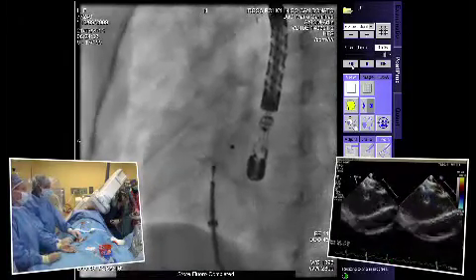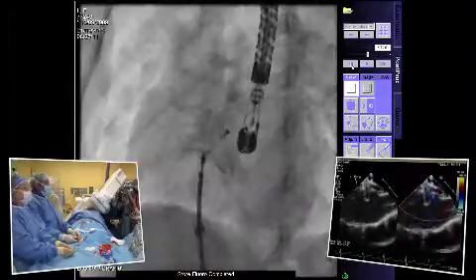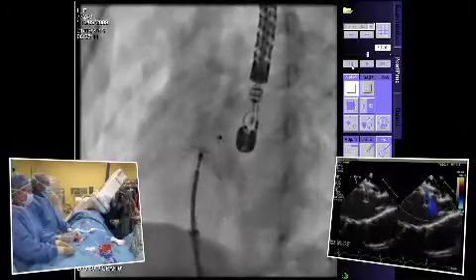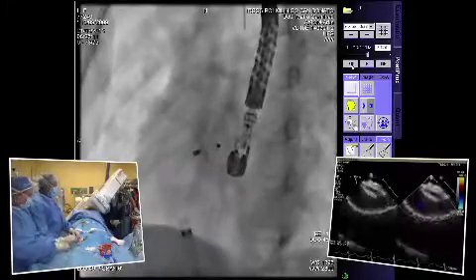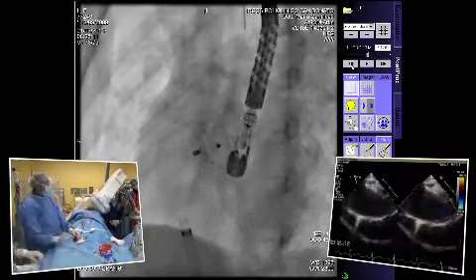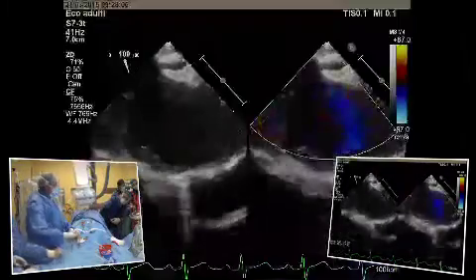So we are going to release the device. Lucien, okay, release it. Come on, straight. Boom. Okay. Perfetto. As you see, the device, after releasing, changed the position, go back to AP. So Aki will show the picture on echo.